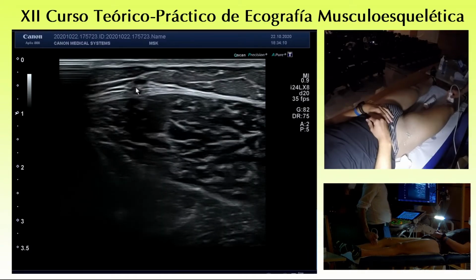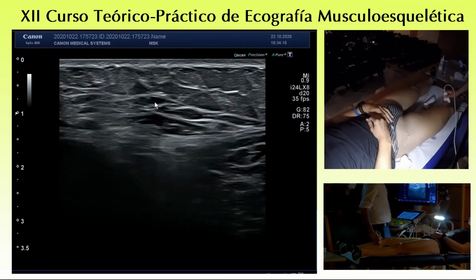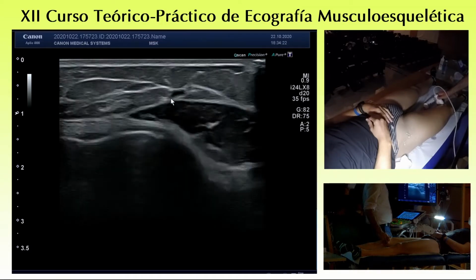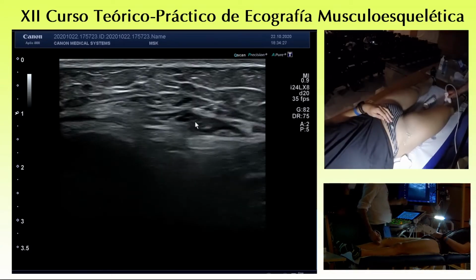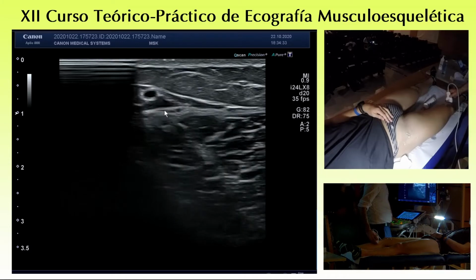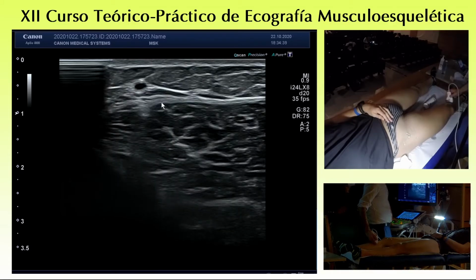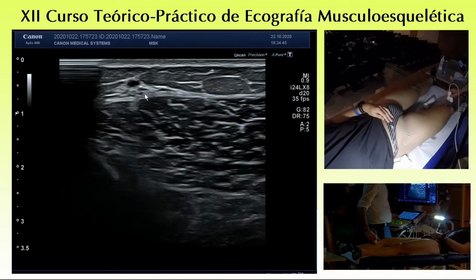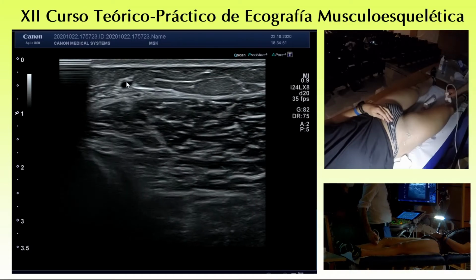In case of intervention on the saphenous vein, for varicose veins, this could be an area where there is some cicatricial tissue, some scar tissue, that could cause an entrapment of the nerve, with consequent pathology. You have to keep the probe very light to not compress the vein. You see, for instance, these branches of the saphenous go very close to the vein at this point. So this is a possible site of scar tissue when you have an intervention over the saphenous vein.